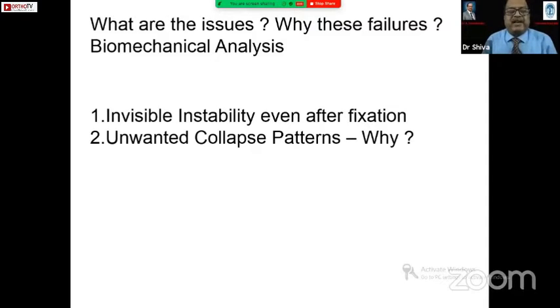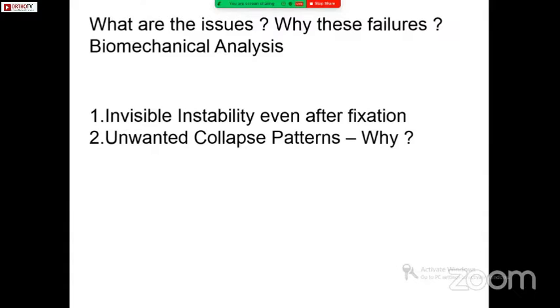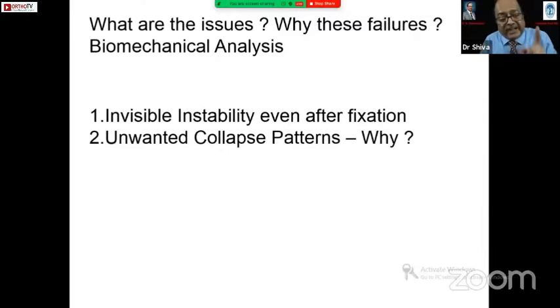Sir, Tanna sir, I would like to disagree there, because the nail has been used as a spacer without making a proper centering hole in the nail. So again, Shiva, you were talking different, I am talking different. Even though the lesser trochanter doesn't play a role, here in this case, definitely the lesser trochanter is broken and also the nail is working as a spacer. There are two things which are not good for the fracture to go further. That's why it has failed.